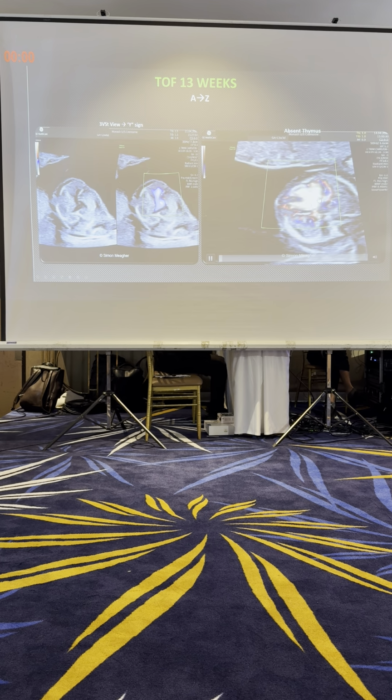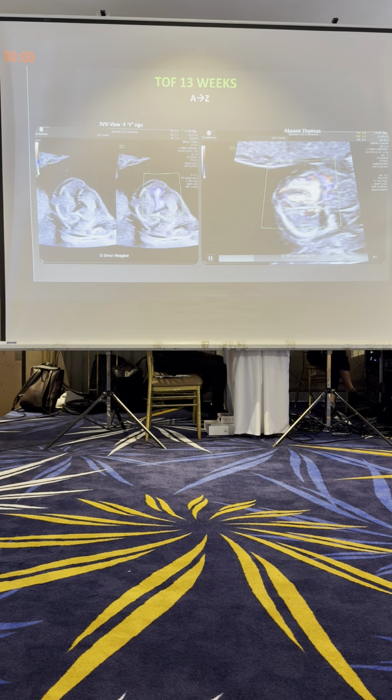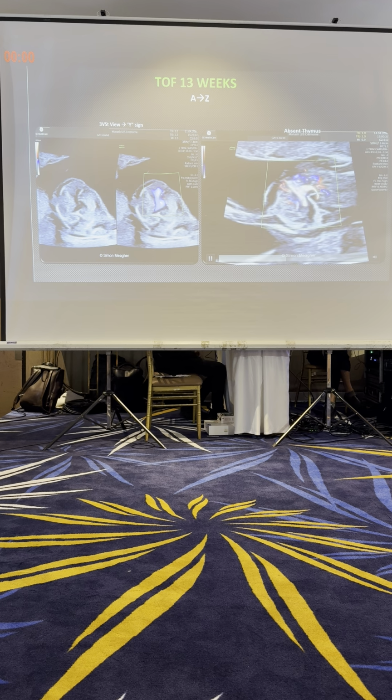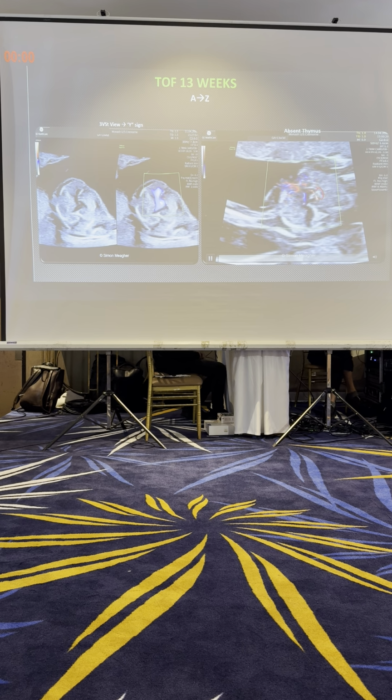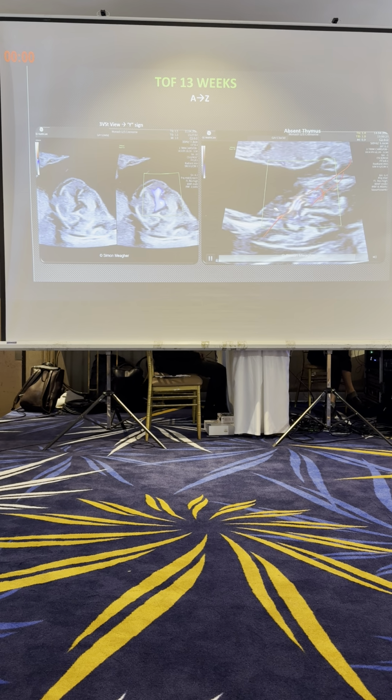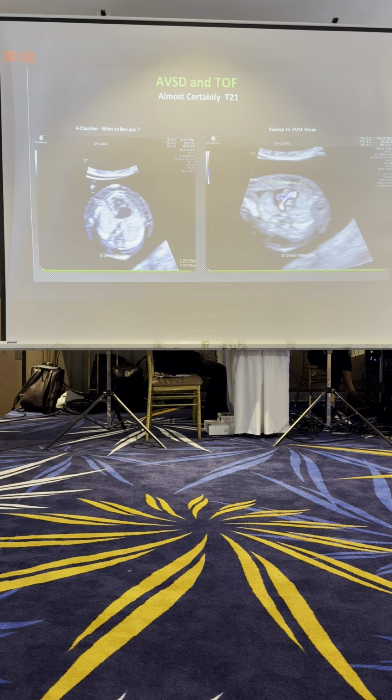I then look at the neck with slow flow, and when I sweep to the neck with slow flow, I appreciate that there's no thymus gland present. Because when I come up looking with slow flow, I see the azygos vein, I see the internal thoracics, I can see the subclavian artery and vein, but I'm right up against the sternum. There is no brachiocephalic vein, and then the sternum, there's no thymus. So this is a baby with 22q deletion with tetralogy of Fallot, a call that is made in the first trimester of pregnancy.